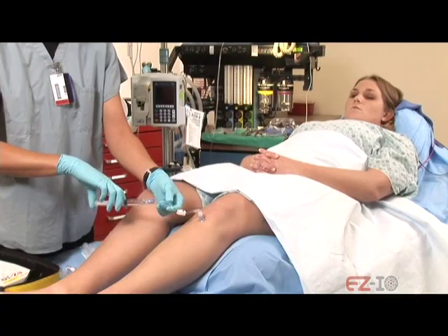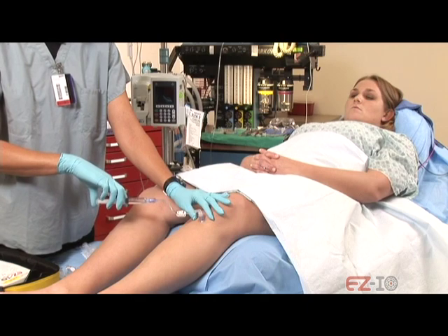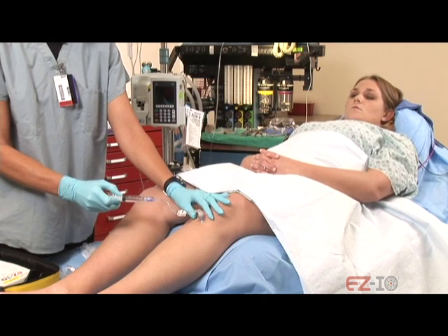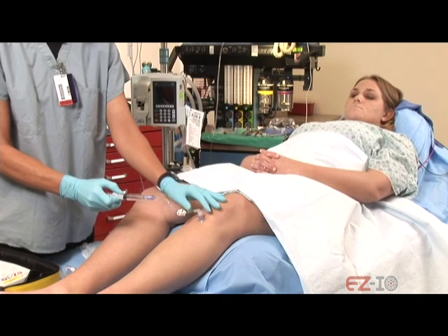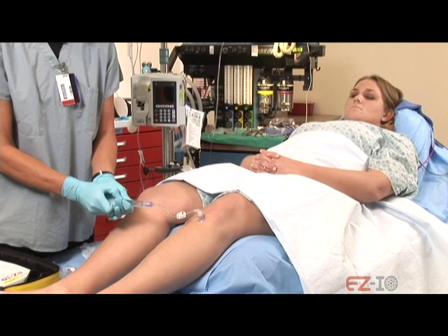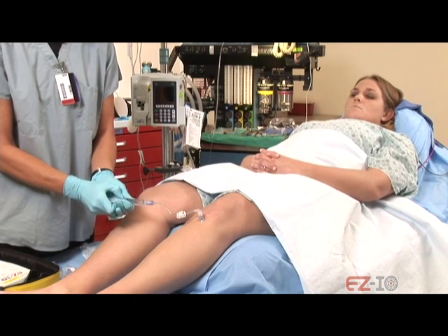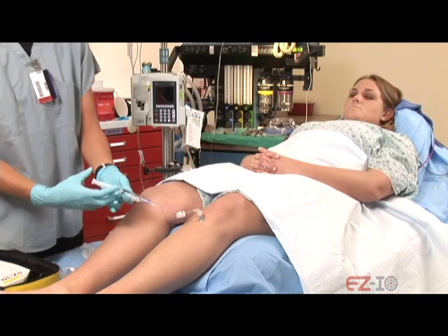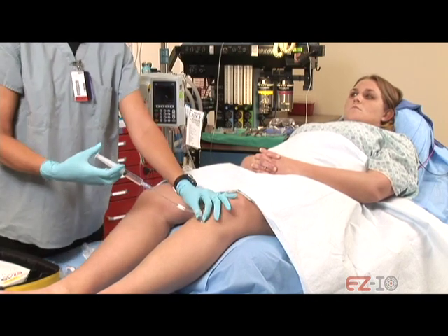Now again, we're just going to go slowly here. Doing okay? Still doing okay? What's your pain level on a scale of 1 to 10? Like a 4. Okay. All right, now this next flush needs to go in pretty quick.